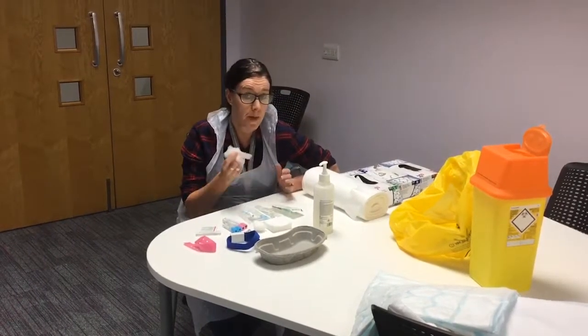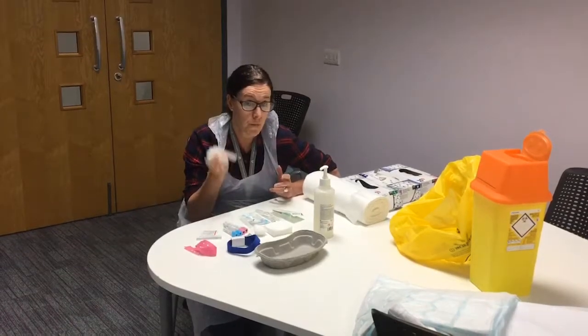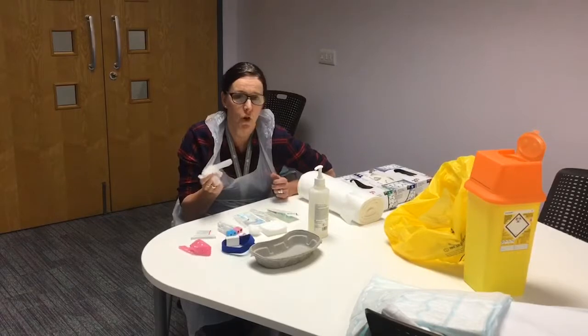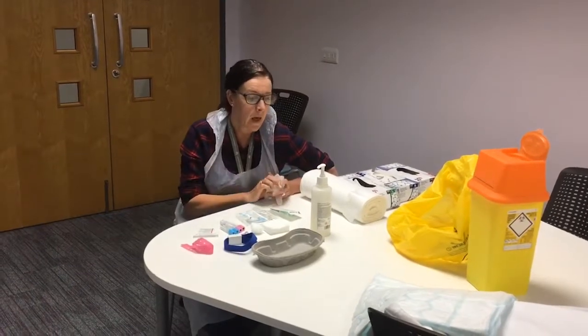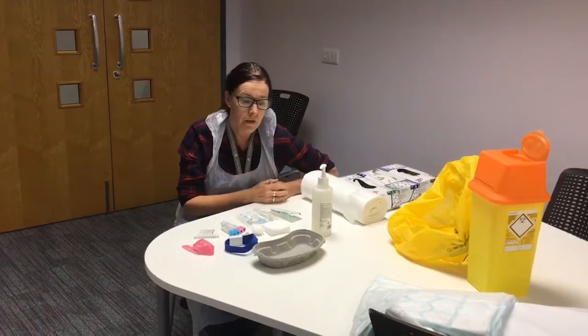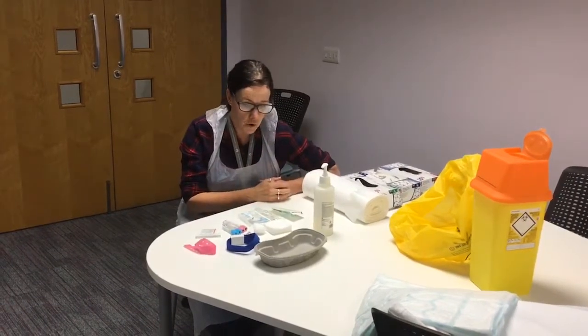It's important to make sure you've got your PPE — your appropriate gloves, make sure they fit properly. You must wear gloves for these procedures. It's not an opt-out, it's essential. You've got some hand gel as well, so when you're selecting your veins, you can clean your hands thoroughly first as well as having washed them.